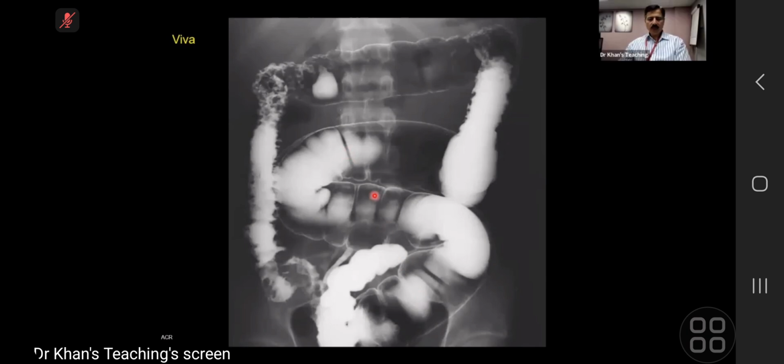Okay, I'll take over. All of the features in this film are in keeping with Crohn's disease and are not in keeping with ulcerative colitis. So what are the features in favor of Crohn's disease? First of all, deep ulcers. And if you see, these are in profile. This is a classical rose-thorn ulcer. You can imagine that this must be the thickened bowel and the ulcer is going in. When you see it in profile, it goes into the wall.